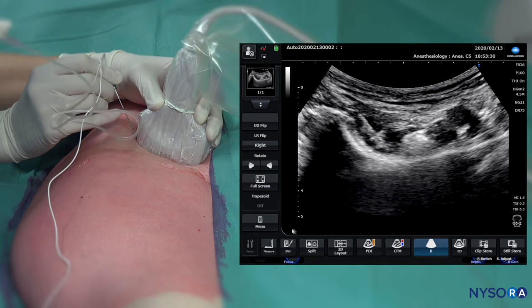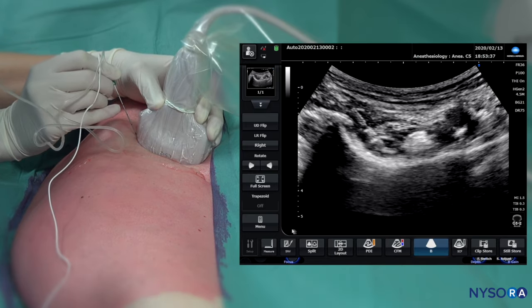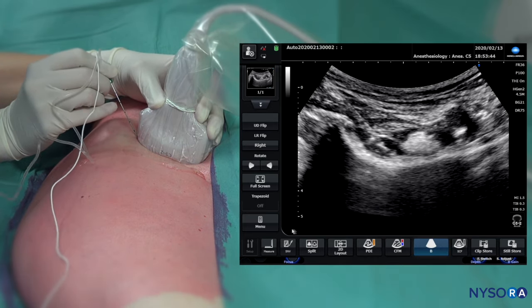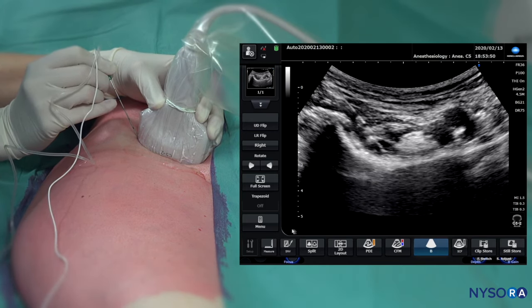Here we can see layering of the local anesthetic over the ramus pubis. At the same time, we can see how the iliacus muscle is being lifted by the injection of the local anesthetic. Local anesthetic tracks underneath the psoas muscle as well. That's one simple injection to accomplish analgesia after anterior hip replacement surgery.